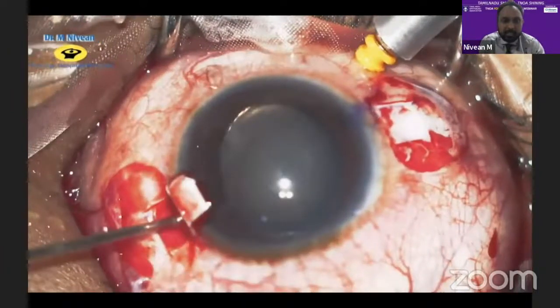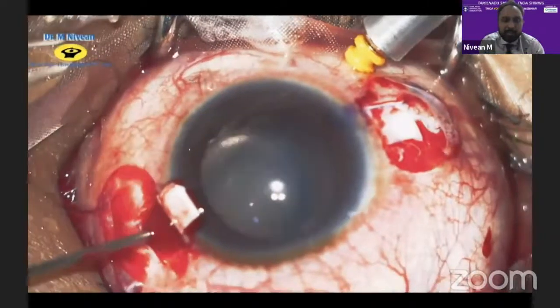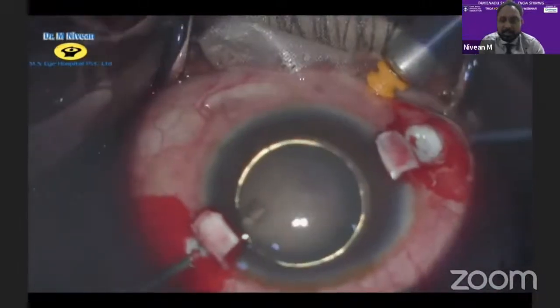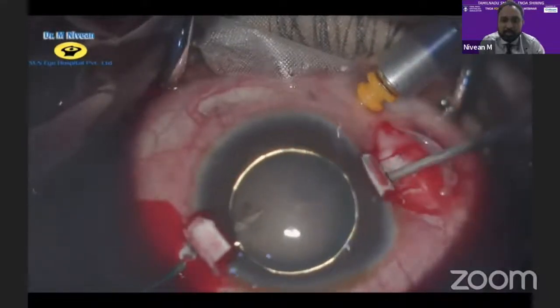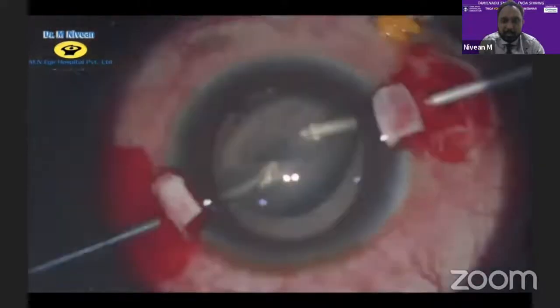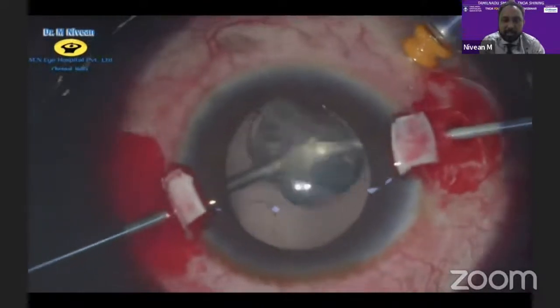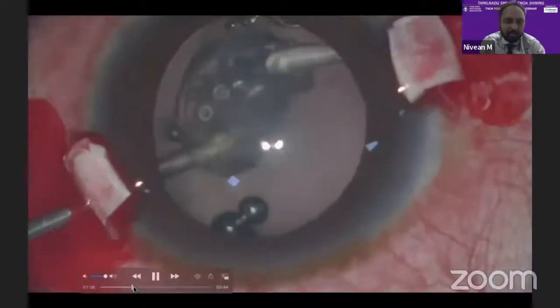The second thing done differently in this case is we did not use extra trocars because we already have these 23 gauge sclerostomies. So we just used a needle to stabilize the lens, because as surgeons, you know that once it goes back, it becomes a whole new ballgame in the vitreous cavity. So I wanted to puncture it from the posterior aspect after cutting a little bit of vitreous, and seeing it's a soft lens, using a combination of high speed cutting and vacuum, the entire lensectomy could be performed, making sure none of these bits fall into the vitreous cavity.